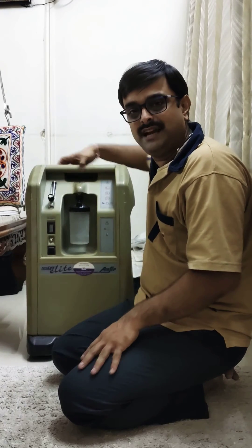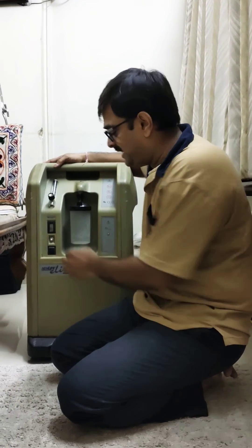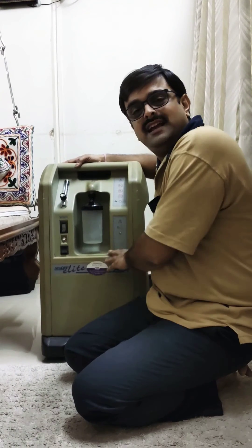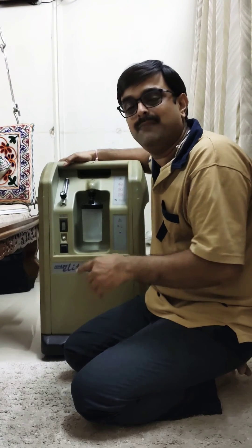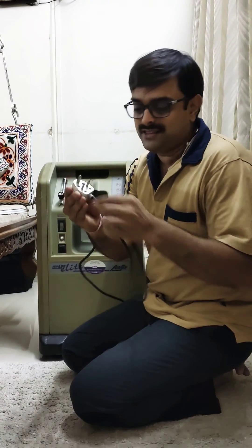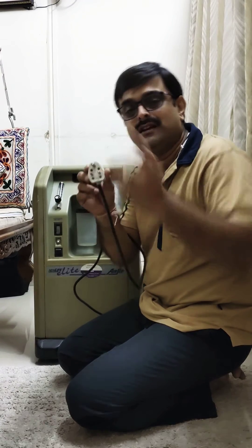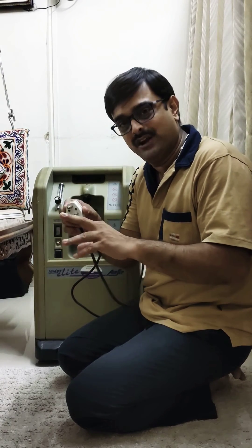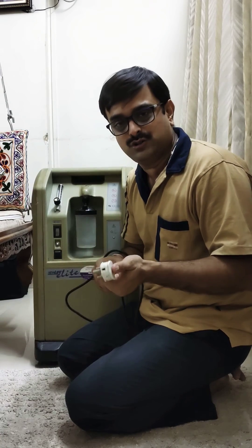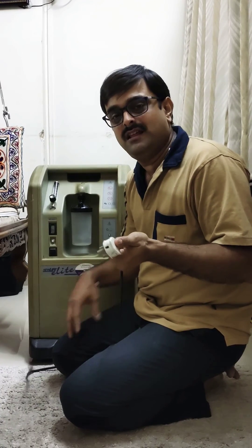Now another issue is that the machine is giving a beep sound and the machine is not working. This is the sound you are hearing right now — a continuous beep sound. This is the indicator by the machine that it is not receiving power. In this case, check this power plug whether anything is burnt or loose, and then refix this into a different plug. If you are using it in a bedroom, try to change the plug and check whether the machine is working or not. Sometimes the plug itself is also not working.